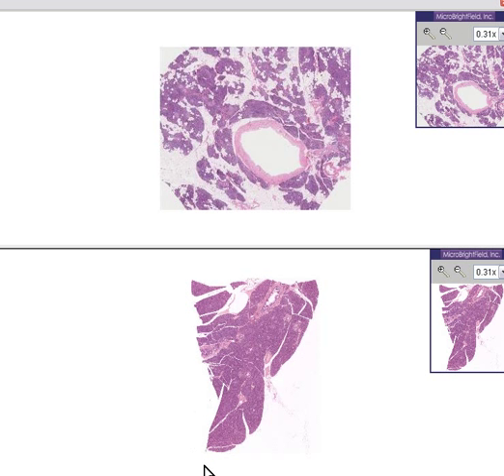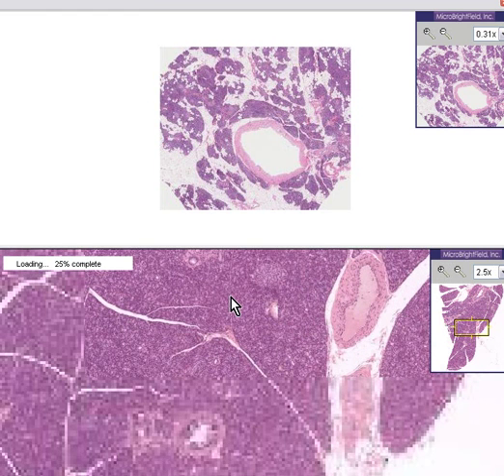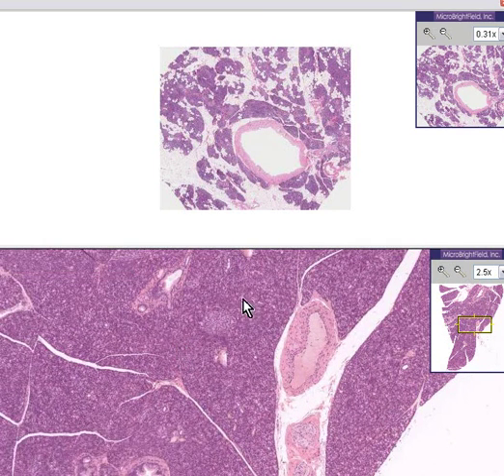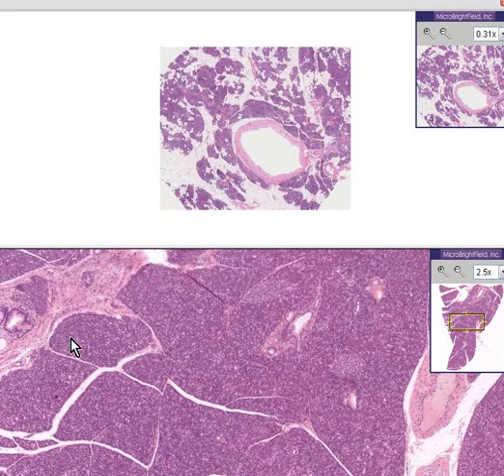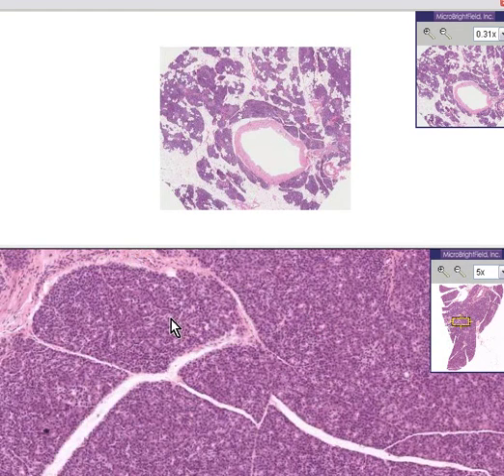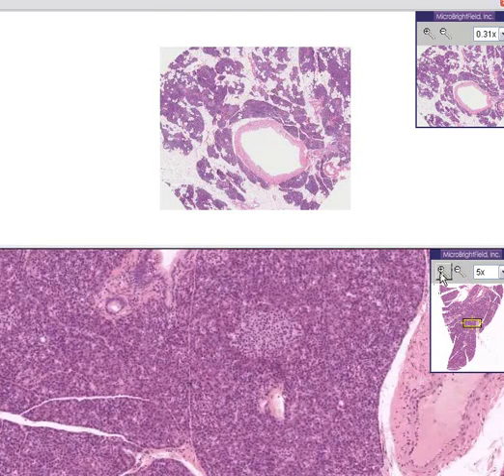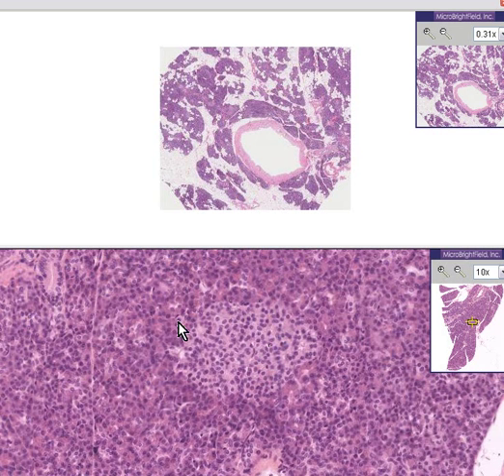On the bottom we have a normal organ — you can recognize it as a pancreas because you can see lobules. The lobules consist of acini, and just to prove this is not a salivary gland like a parotid, we also have these nice little islets of Langerhans in which you can see the cell outlines and nuclear outlines very nicely.